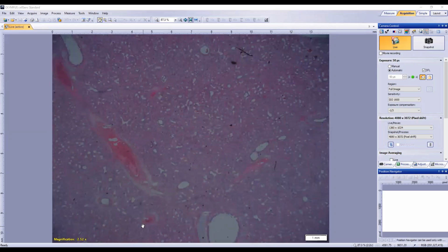So each one of those should send us down pneumoconiosis. Yeah, that's a good one. Each of these will send us down a different path, because apart from the viral causes, most of these other causes will have a different subgross picture. So fungal pneumonia should look a bit more like a rhodococcal pneumonia, multifocal to coalescing granulomas. So we've talked through viral causes, bacterial causes of, sorry, not type 1, of an acute lung.